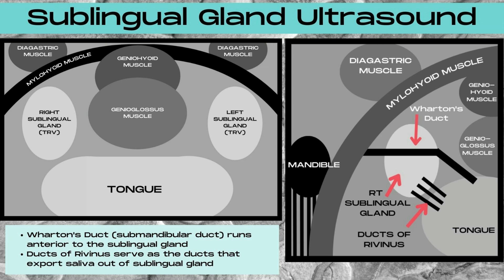Now let's look at the sublingual glands on ultrasound. On the image to the left, if the transducer is placed in a transverse plane below the chin bone and then angled up towards the tongue, you can visualize the hyperechoic tongue in the bottom portion of the image and the genioglossus and geniohyoid muscles anterior to the tongue. There's going to be a dark circular stripe on the ultrasound image — this is the mylohyoid muscle — and below this muscle, sandwiched between the mylohyoid muscle and the geniohyoid and genioglossus muscles, are going to be the right and left sublingual glands.